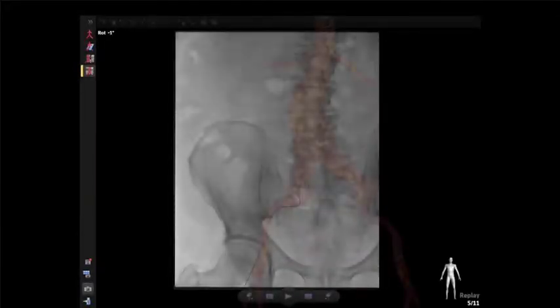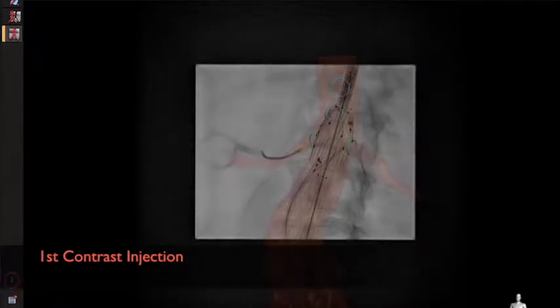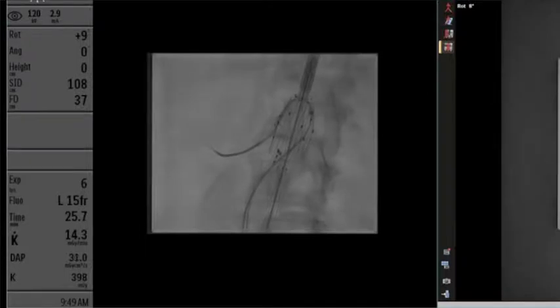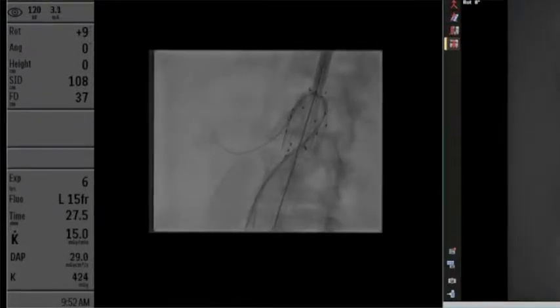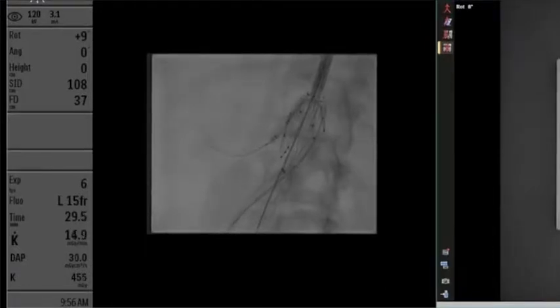Now we're ready for live guidance. We can see our puncture above the bifurcation. We pass a wire up through the aorta into the thoracic aorta, then position our device and uncover it. We then cannulate the right renal fenestration through our ring marker into the preoperatively mapped right renal artery, pass a catheter out — this is the first contrast injection performed for this patient — then switch for a stiff wire. In this patient, we had to use a balloon to facilitate sheath placement.